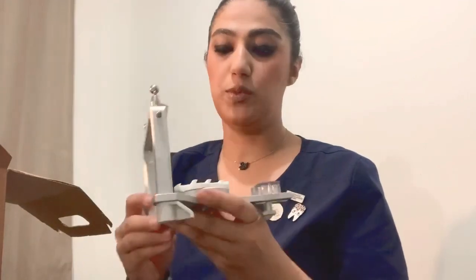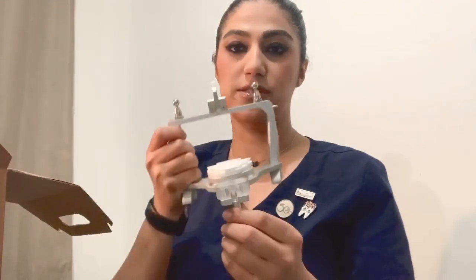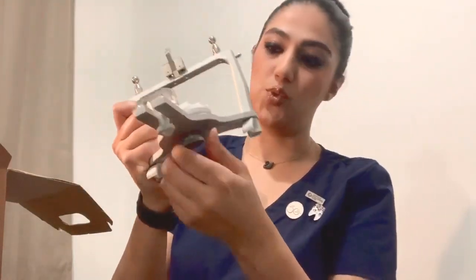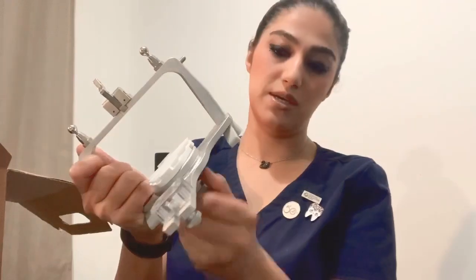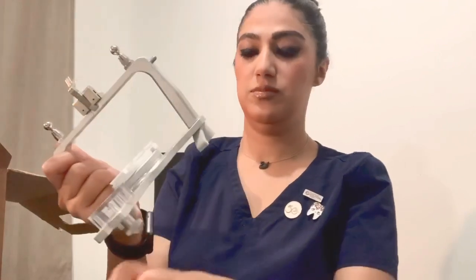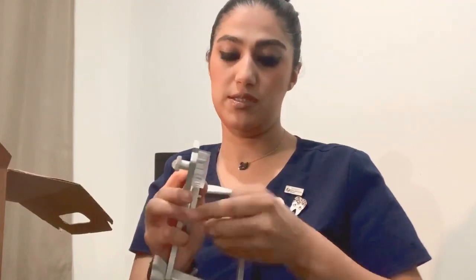This is the box of the articulator. This is the lower member of the Whip Mix articulator. As you can see, there are a couple of parts here. This is the incisal table — you can move it forward and backward, and there is a screw here. This is the mounting plate, and you can screw and unscrew it and remove the mounting plates. There is a pretty big screw here, and this is the mounting plate that you can detach.